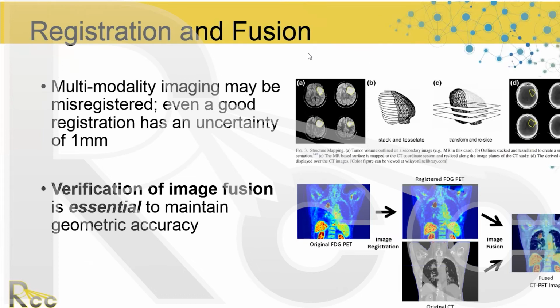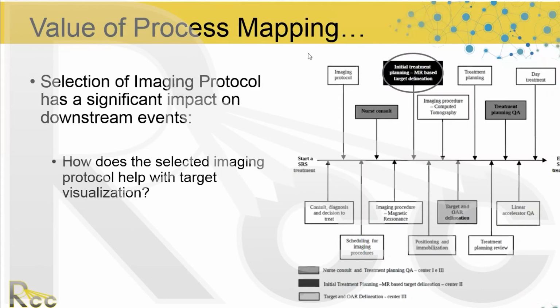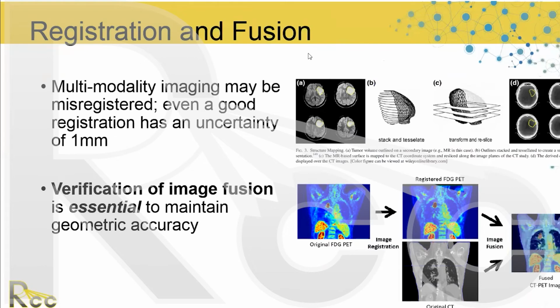Have you gone through it before, like how the MIP is created and how the minimum or average intensity is created, or has it not been mentioned? No, I didn't mention that. I think we covered this in the earlier sessions, so those are all in the Google Drive to access and review. I think the question is for IGRT. It's a little confusing which one is used for which disease site.